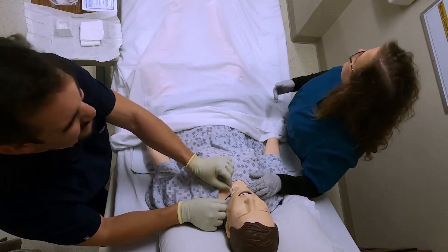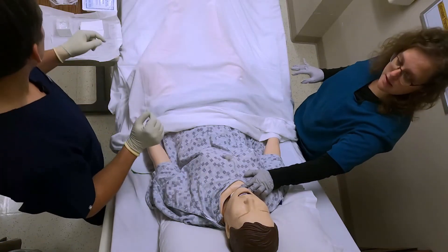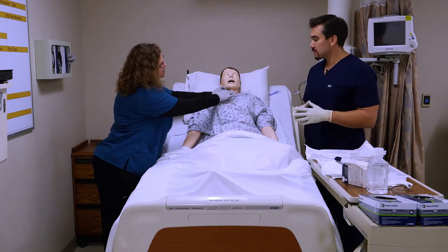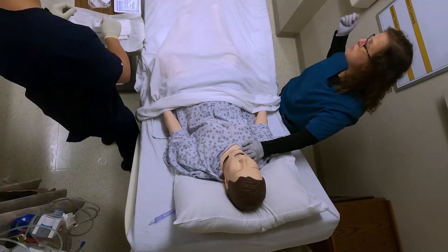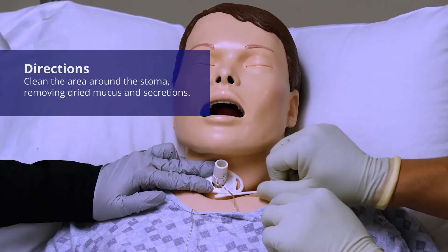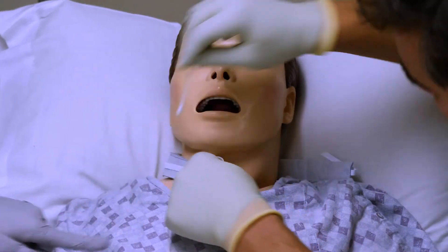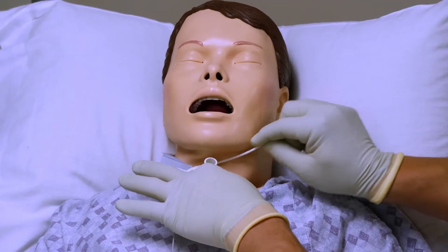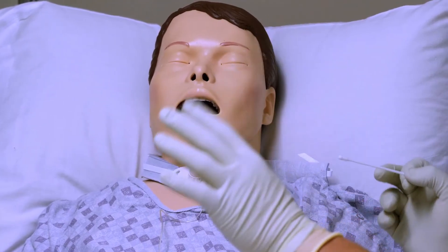Make sure that you don't put your face in front of the cannula — if you've been a nurse long enough, you'll learn that the hard way. You can clean a couple of different ways: if you just have gauze, put saline on it and clean under the trach; if you have q-tips, get them moist and clean under it. The q-tips are actually a lot easier. You'll notice I'm holding on to it with one hand — you don't really want to take the ties off without holding on to it. If a patient coughs and the trach wasn't inflated all the way, that thing can fly across the room and now you have a compromised airway.